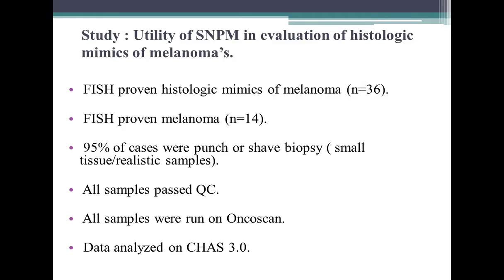these histologic mimics. So, for the initial evaluation using the OncoScan FFPE assay, we picked 50 cases which were worked out in a reference lab on FISH testing, out of which 36 were histologic mimics of melanoma which were proven on FISH, and 14 were FISH-proven melanoma. 95% of these cases were punch or shave biopsies with small tissue, which are the realistic samples we receive from our derm clinic.